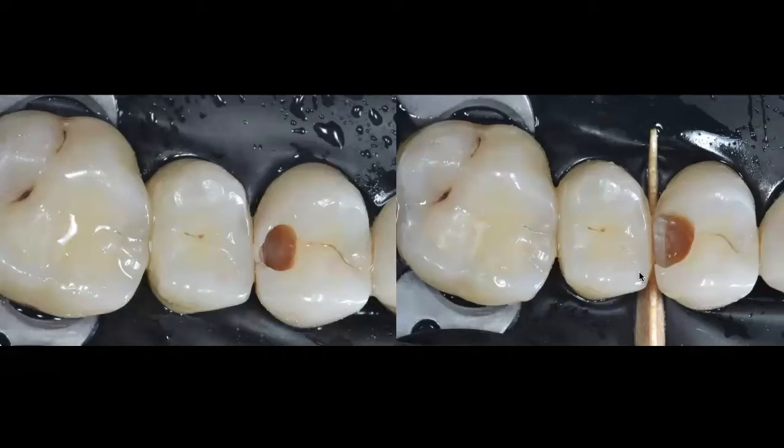Now, today you have a lot of wedges that have a portion of a metal band in them that also may be very helpful. I like more just the regular wedges because I find that there's nothing blocking my view. I have tried to use these plastic wedges with metal inserts that are very useful. You have that metal protecting the neighboring tooth, but for some reason, to my eyes, they just block a little bit of the view. So I'd rather just use a regular wedge. But again, that is another option. If you're using it and it works for you, I wouldn't change it.